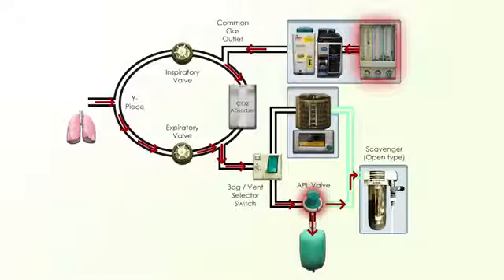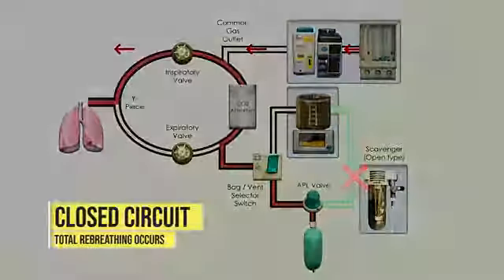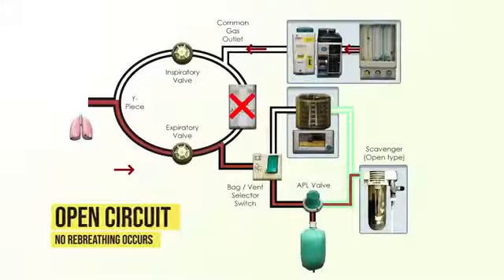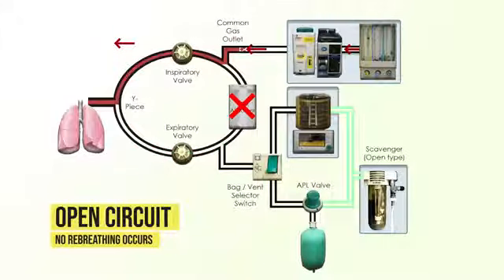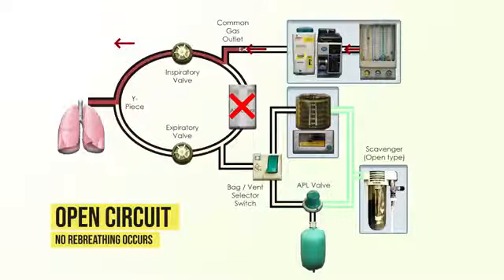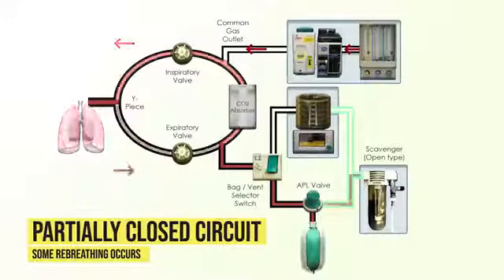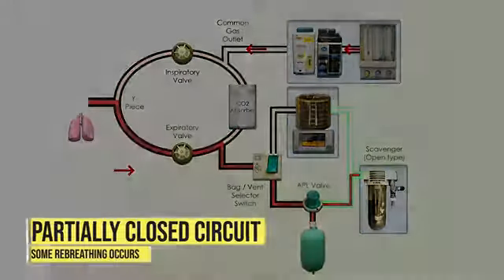This is described, respectively, as being a closed circuit, open circuit, or partially closed circuit. Rebreathing of gases provides for economic cost savings, as much less gas and volatile agent is necessary. It also allows for decreased patient heat loss and improved humidification.